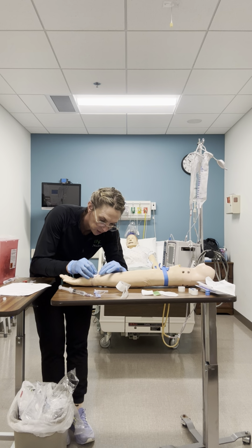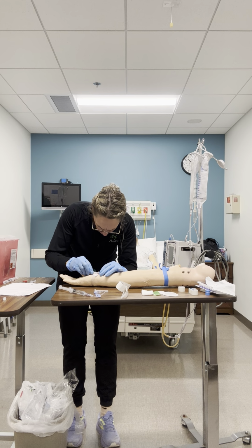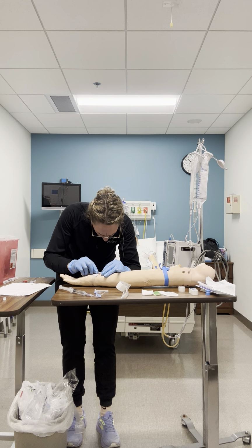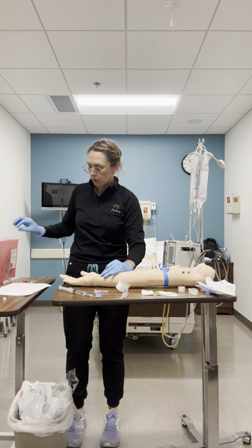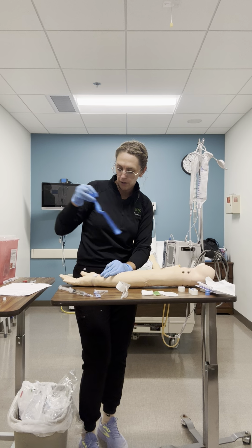So now I'm gonna loosen the catheter from the needle as I push the safety, and I'm going to advance the catheter all the way until it is flush with the skin. And then I'm going to slip the needle out the rest of the way. And I'm going to put my safety on, throw my needle away, and take my tourniquet off.